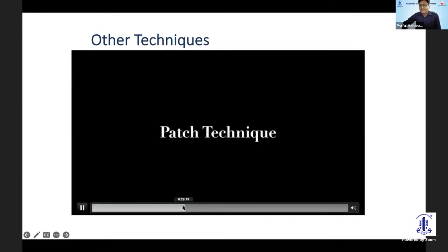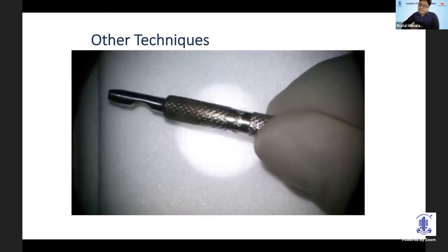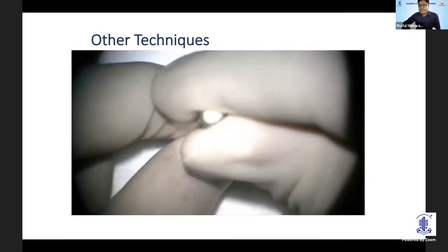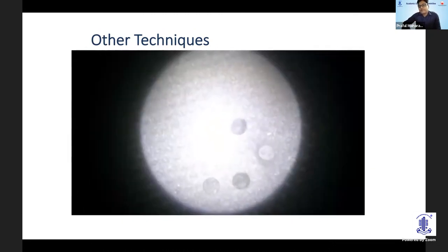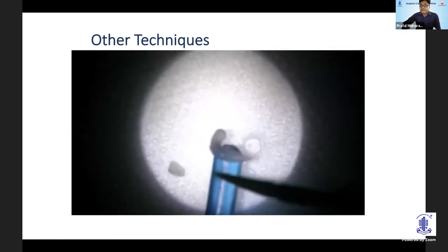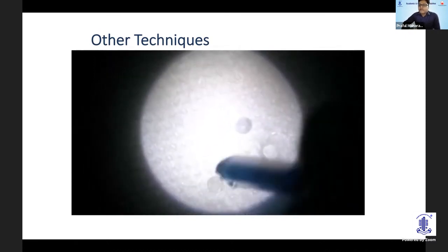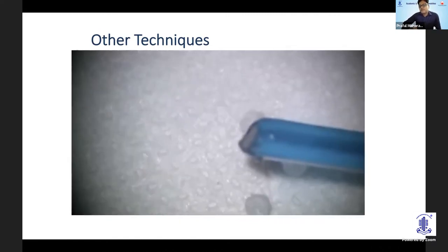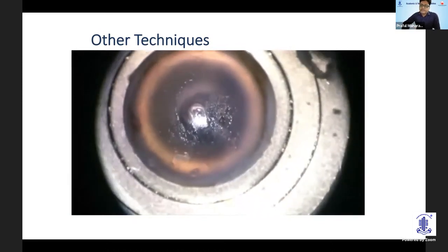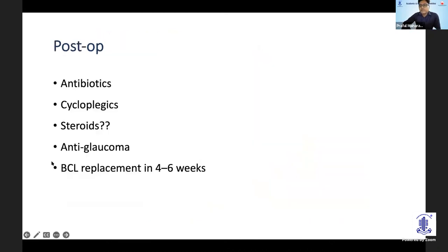The other commonly used technique is the patch technique. You take a dermatological skin punch of 2 mm size, take multiple sections of your sterile drape, and using any blunt instrument apply some ointment over that and pick these small patches. This patch technique is usually useful when the ulcer size or perforation size is larger. The ointment allows you to pick these small patches, apply cyanoacrylate glue to the surface, and just patch it over the area of defect — allowing you to apply a controlled amount of glue.